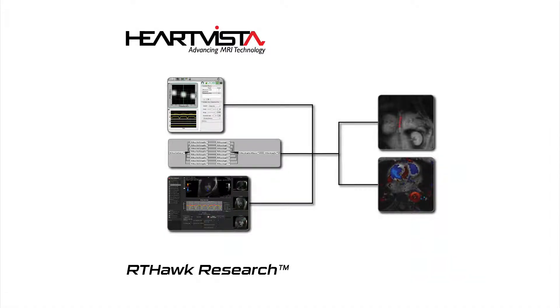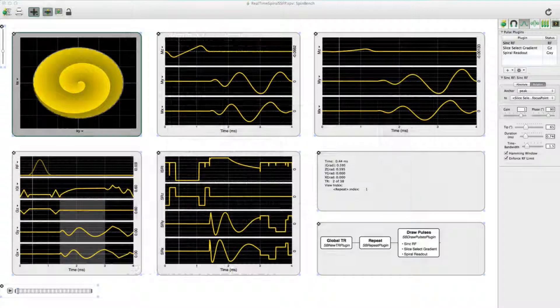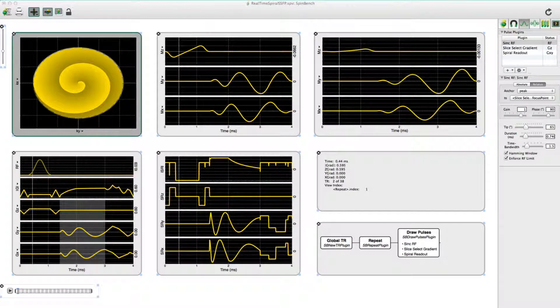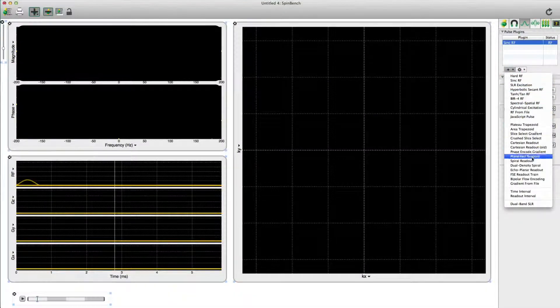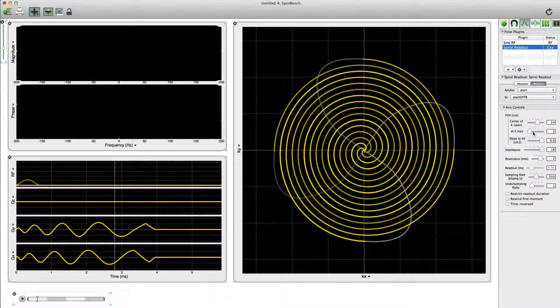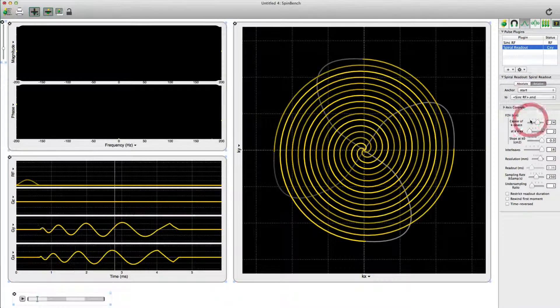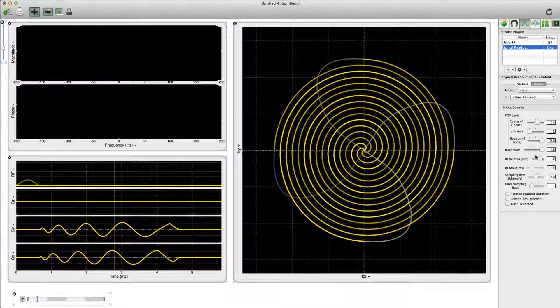RT-Hawk research enables rapid development of advanced and real-time MRI applications. Application development begins with SpinBench, where the user can create pulse sequences using either custom waveforms or pulse plugins from the extensive SpinBench library. These plugins can be synchronized with a collection of timing parameters.